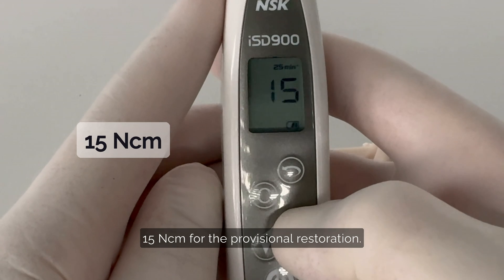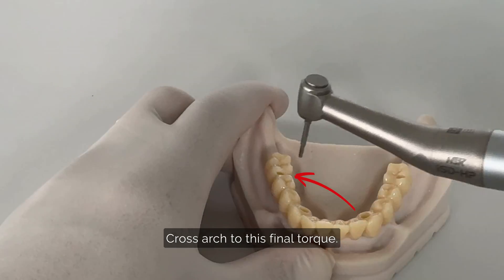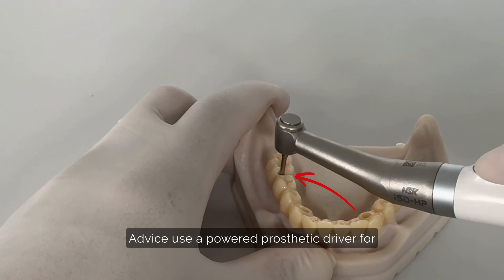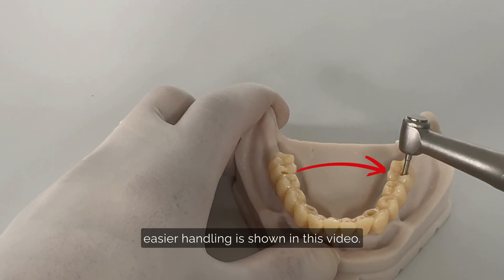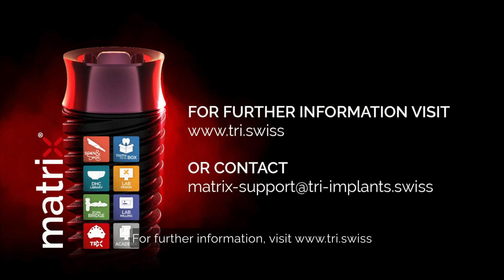Proceed to tighten all screws cross-arch to this final torque. Using a powered prosthetic driver for easier handling is shown in this video. For further information, visit tri.swiss or contact our Matrix support team.